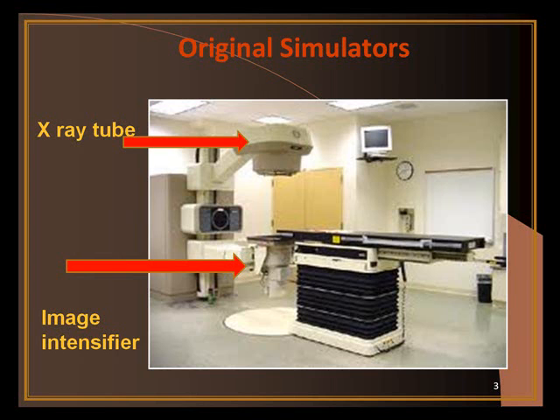They hit a CCD. They get focused down to an area like this, and they hit a CCD camera down here. Okay, and the image from that CCD camera then goes to the monitor that shows the pelvis or the patient, whatever you're imaging. Okay, that's a bad picture of a monitor, but this monitor is in the control area. So basically the II takes the X-rays, converts them with the photocathode to electrons. The electrons are focused down to a CCD camera, and the CCD camera, you know what a CCD is? A charge coupled device. It's just what's in your video cameras. And then that gets displayed on the monitor.